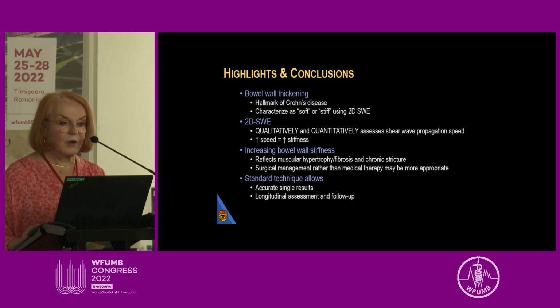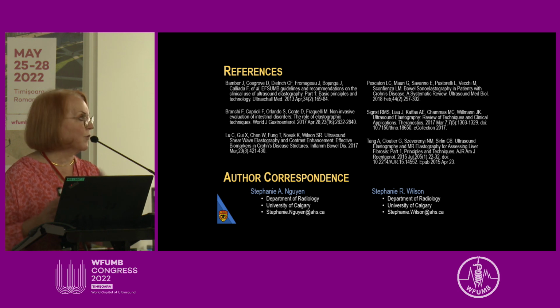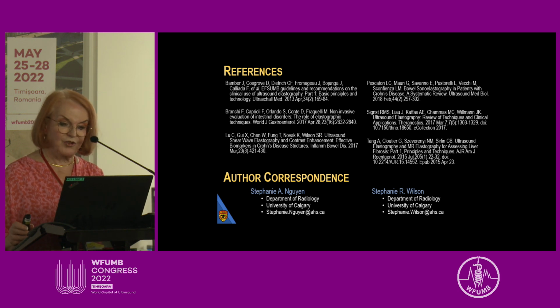So conclusions, we feel that bowel wall thickening is the hallmark of Crohn's disease, and our ambition is to characterize this as soft or stiff bowel using 2D shear wave elastography. And so qualitatively and quantitatively, we believe that increased propagation speed is very valuable for us and also for predicting therapeutic response. And these are just the references that we've used in our preparation of this material.